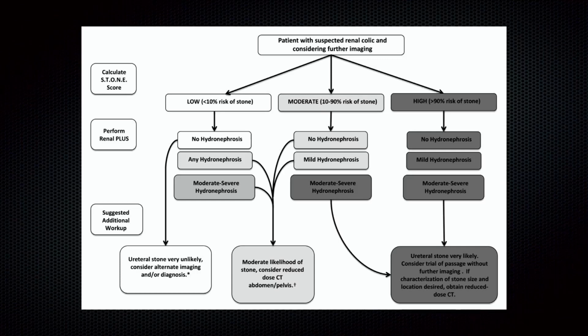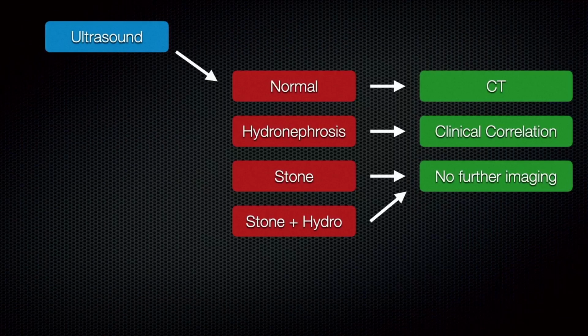I think if we're really practical, based on experience and how we utilize this, a very pragmatic approach is basically to say, okay, you've got the patient with flank pain, right? They're in the right cohort, so in their second, third, or fourth decade of life, maybe approaching the fifth decade of life. Ultrasound them, right? See what you find. You're going to find one of four things.